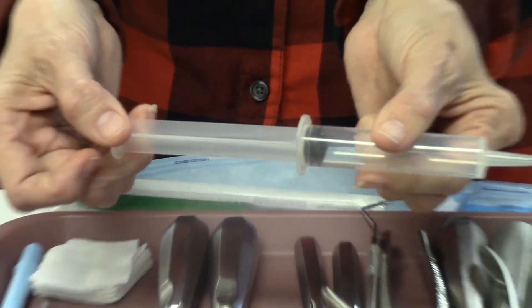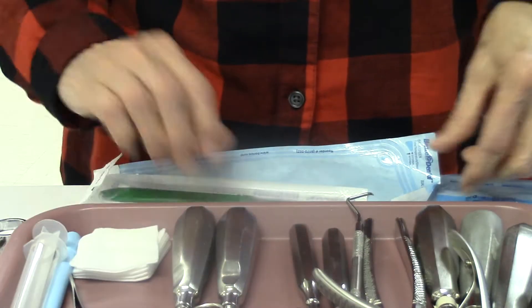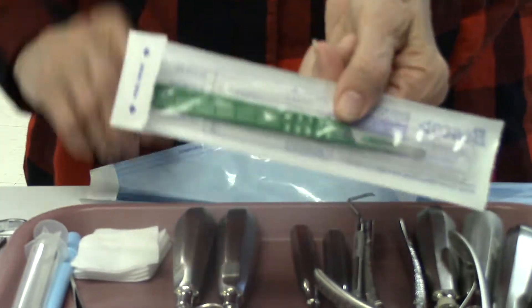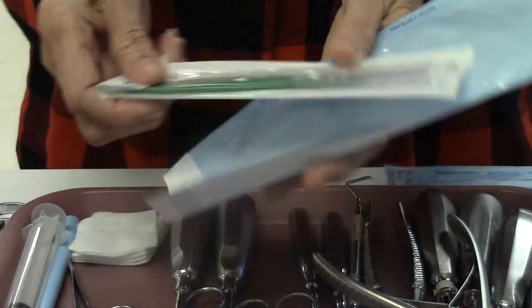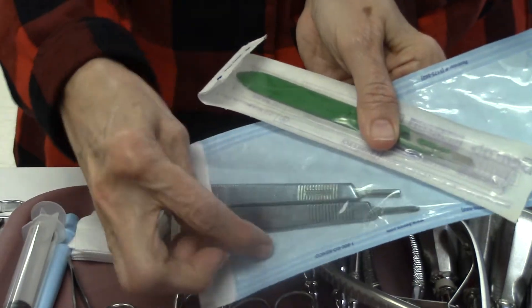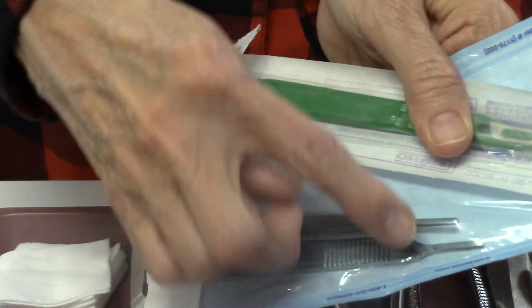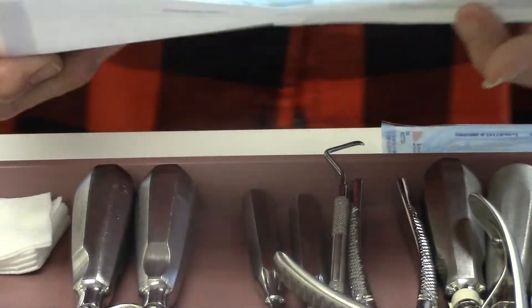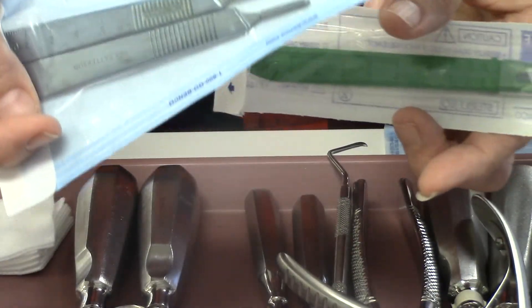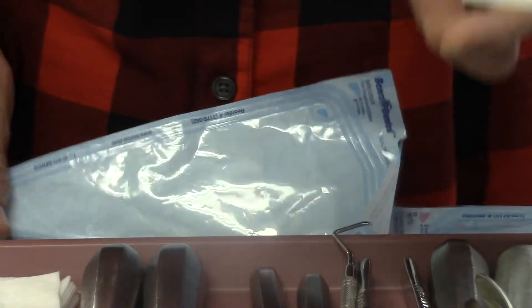We have our monoject syringe again for saline or chlorhexidine. We also have a scalpel — this one happens to be disposable. These scalpels in the autoclave bag are just the handles; the cutting blade actually attaches to the handle. I don't really like these because I think they're dangerous. But a lot of oral surgeons' offices use them, and when they do they usually have scalpel blade removers, which is a handy safety tool.